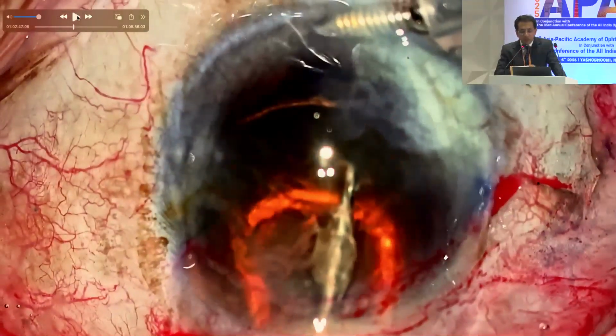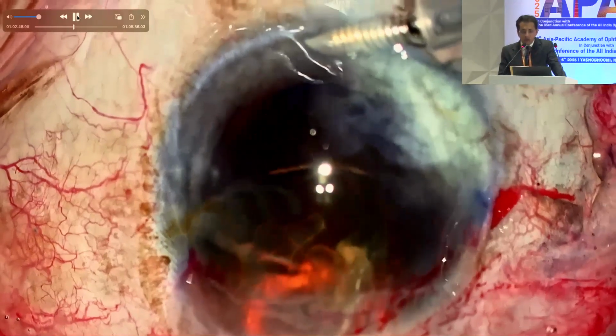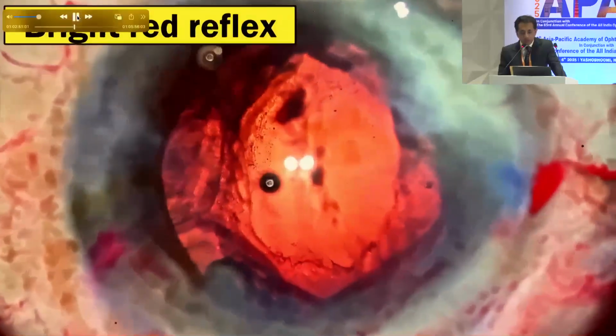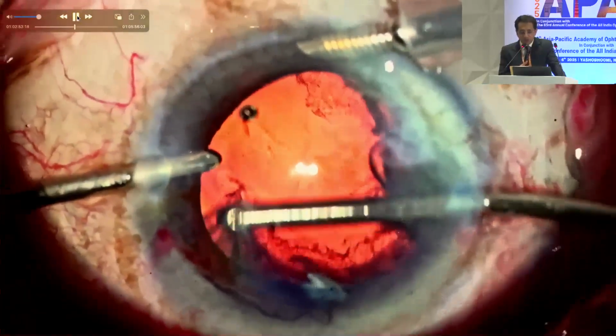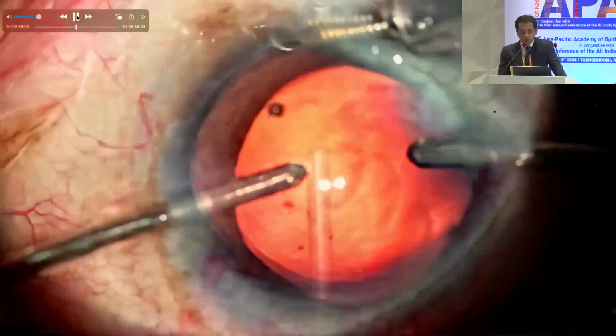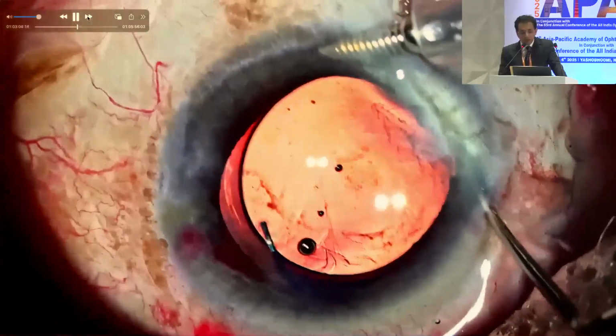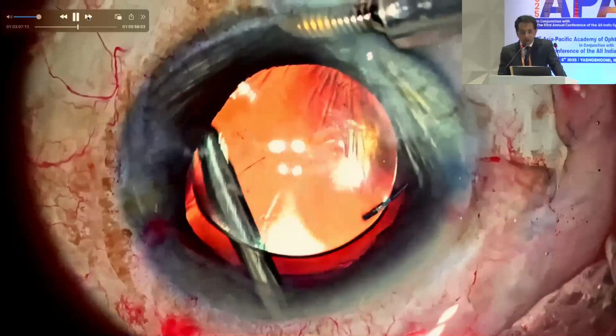The traditional way of maneuvering the nucleus out with an AC maintainer is to just press on the scleral lip and it pops out. But that cannot be used in this posterior polar cataract, because the increased hydrostatic pressure itself can blow out the posterior capsule. So you use a phaco sandwich technique with OVD, but you also turn on the AC maintainer. At this stage the AC does not collapse, and that's why I believe you have a better chance of preventing posterior capsule rupture. The next steps are as usual, nothing much in this case. This is something I've tried and find very helpful.